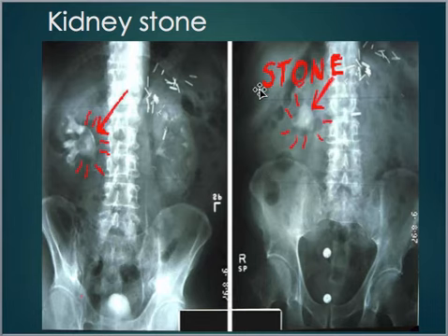They do a procedure called lithotripsy. If you've never heard of it, they take a laser and they go right in and laser the stone, which breaks it up into a bunch of very small particles so the patient can pass it on their own. If they can't do that, they'll use what they call the basket technique, where they hold the stone and pull it out manually.